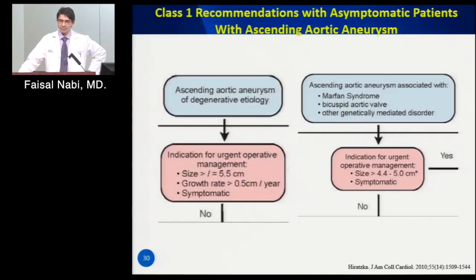Your question basically raises a great point, and we should probably ask John one day too, see what their opinion is. But it is curious that yes, we report absolute sizes, but if it gives you any insight into your patient, that this aorta, if it's 2.8 and it's now 3.8, she's in the moderate range, maybe you worry a little bit more, but it's all great thoughts.